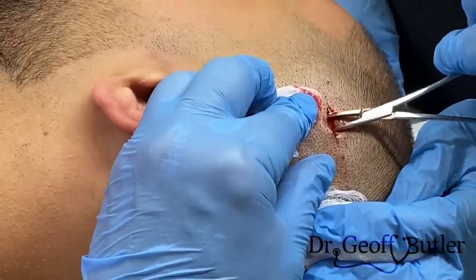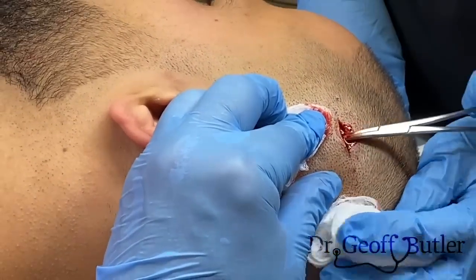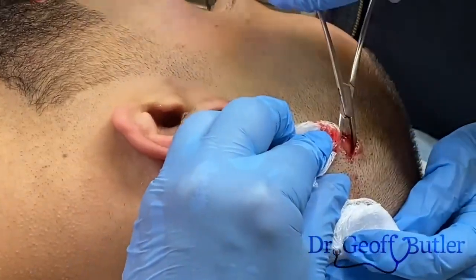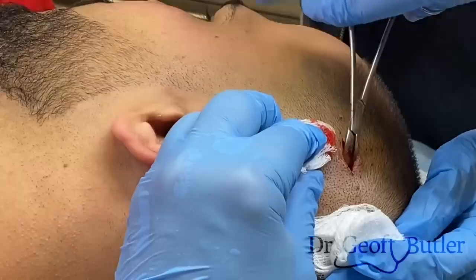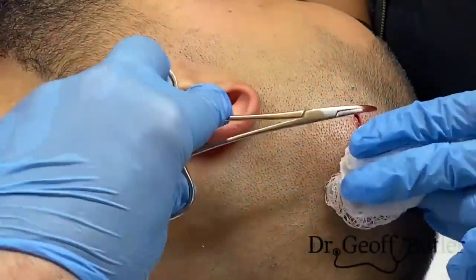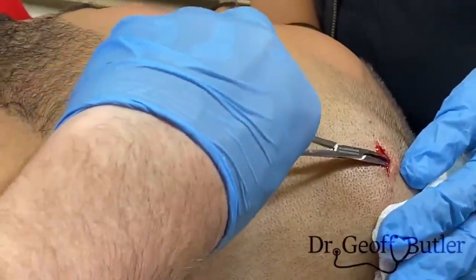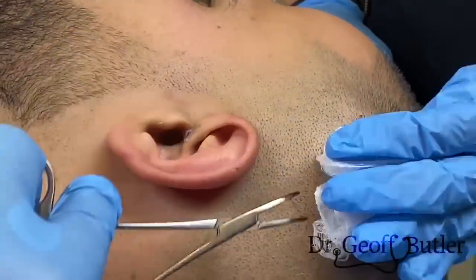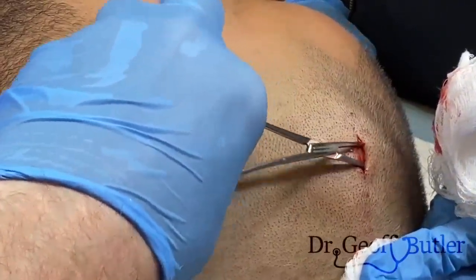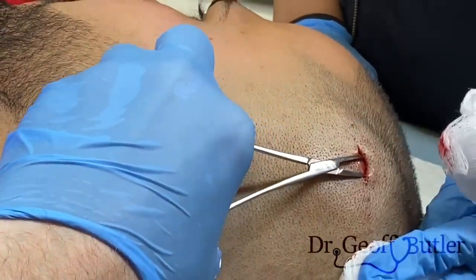So now essentially all we want to be doing is dissecting this down on both sides. Try to open this up and see if we can get that out. So now I can easily see it, that's the cyst membrane that's there. This looks completely normal and benign, so just like we thought, this is more cystic than anything else.